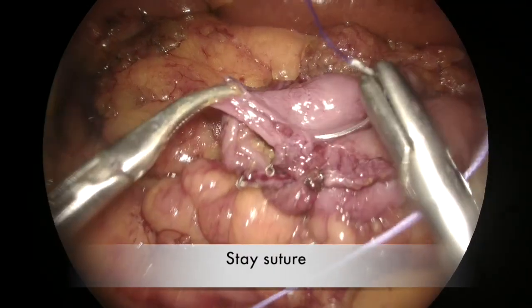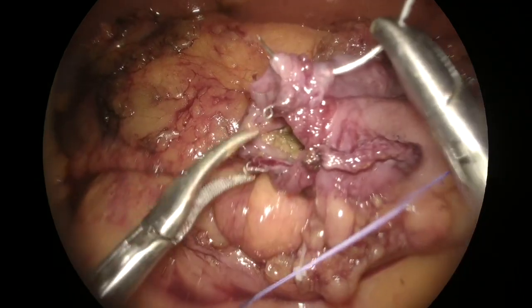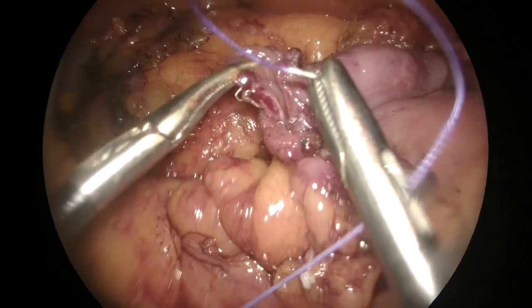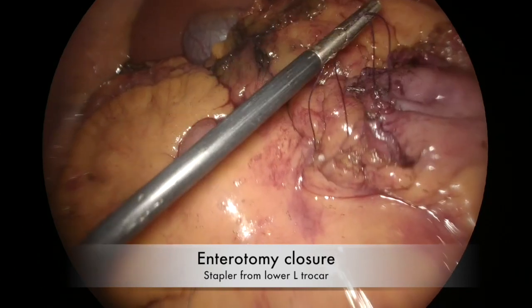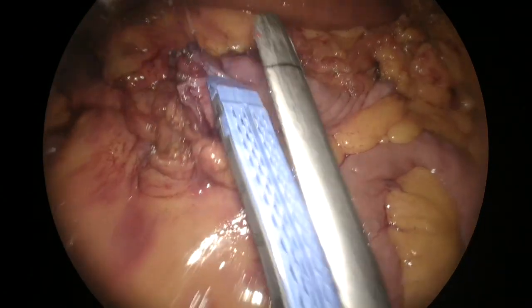A stay suture was placed to ensure good traction on the posterior and anterior wall of the anastomosis. Finally, the enterotomy was closed with a further 60 mm blue cartridge, coming this time from the left lower trocar.